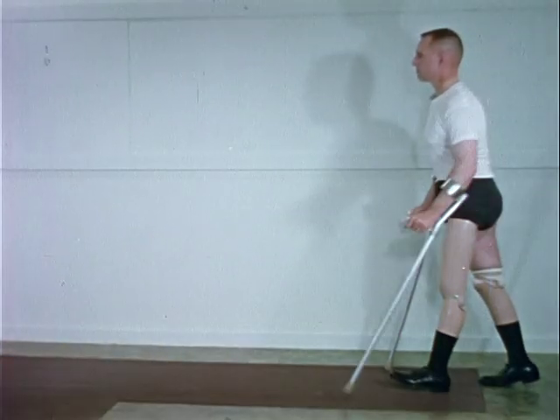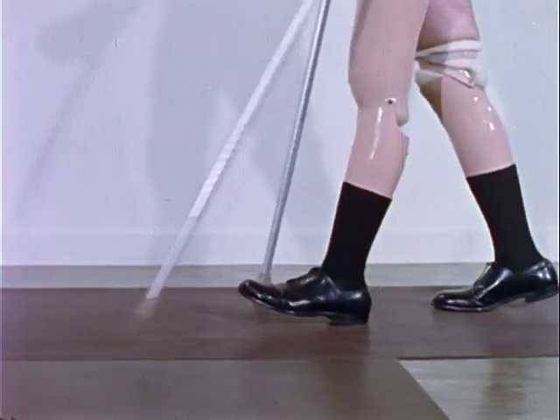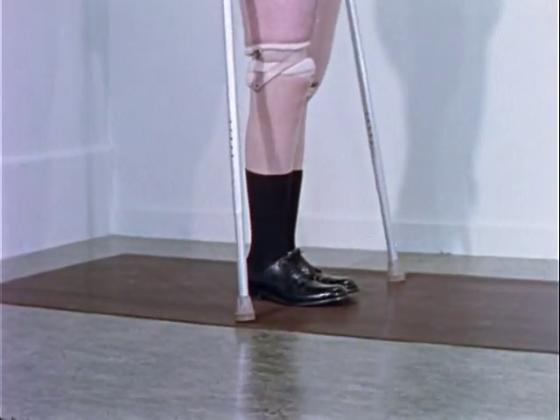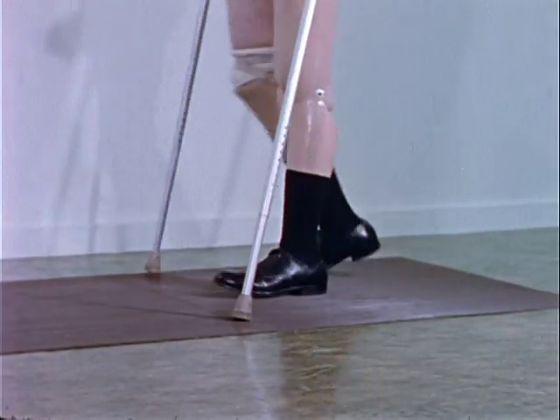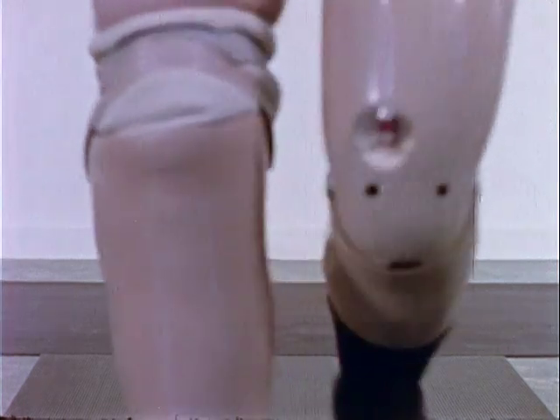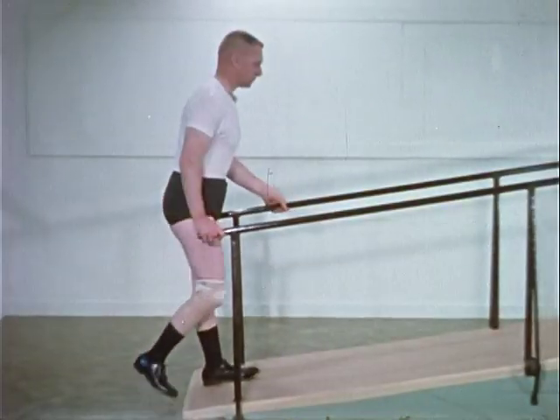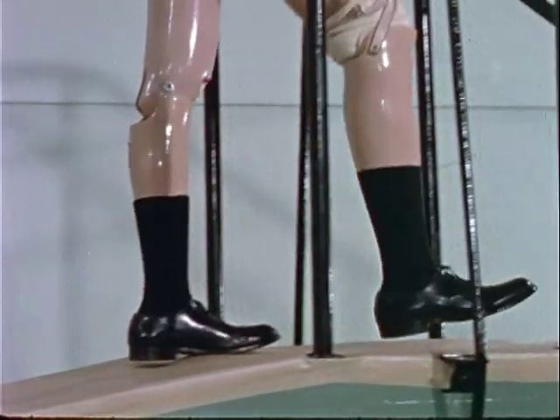The patient begins ambulation out of the parallel bars with the four-point crutch gait. The two-point gait is a natural progression as balance improves. Finally, the cane may be used for walking on level surfaces. When walking on inclines, the patient takes a shorter step with the above-the-knee prosthesis. In ascending ramps, this short step compensates for the limited dorsiflexion of the foot.